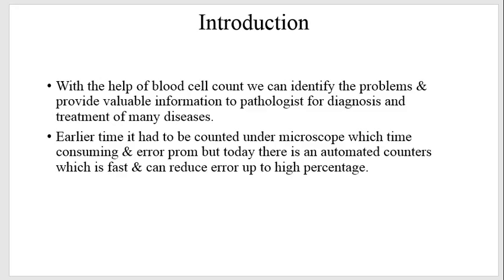Now with this project, what we are going to do is provide valuable information to the pathologist for their treatment. So we are trying to replace an expert who can look through a microscope and tell us what is the problem in the blood. We are taking a software which will be cross verified with the expert's information, and depending upon the corrections he suggests, we will set the values in the software so that most of the expertise can be made available in remote areas, villages, everywhere, where the expert need not be present all the time.